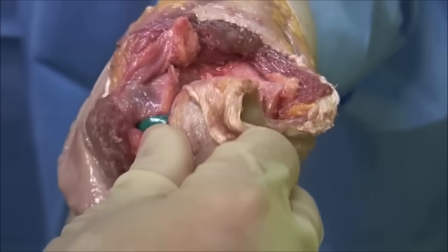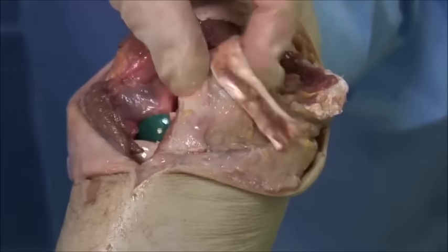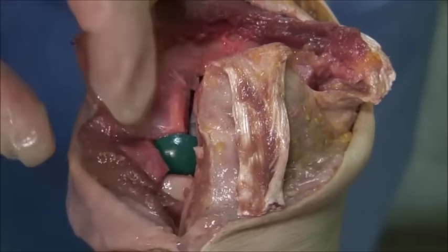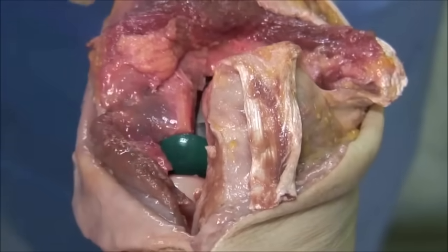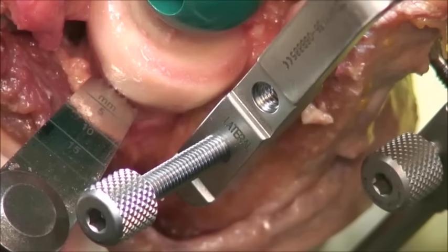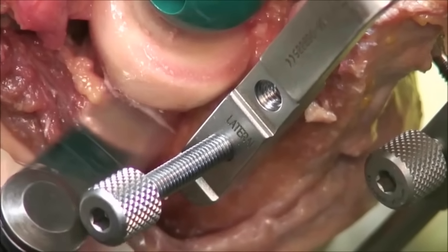Flexion and extension of the elbow is tested as well as valgus and varus stress. If necessary, the radial head can be excised now; excision is advised only if radiocapitellar osteoarthritis is present.